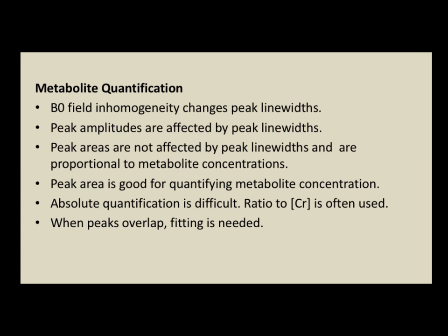But when we talk about concentration, in most cases, it's a relative quantification. We use a ratio like NAA to creatine ratio, glutamate to creatine ratio. A ratio is always easier. Absolute quantification is very hard. When the peaks overlap, it's not straightforward to compute the peak area, so some sort of fitting is needed.